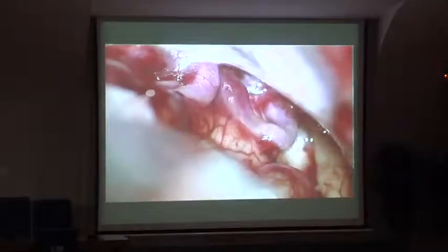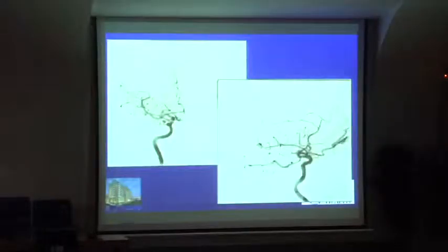So this is a patient we were talking about a second ago. This guy presents with a hemorrhage, has a typical anterior cranial fossa dural AV fistula. Probably today I would have tried to go transvenous to get to the vein to this point and just embolize retrograde. Back then, I had a series of 5 cases where I went to the ophthalmic, I'm feeling brave, this is awesome.